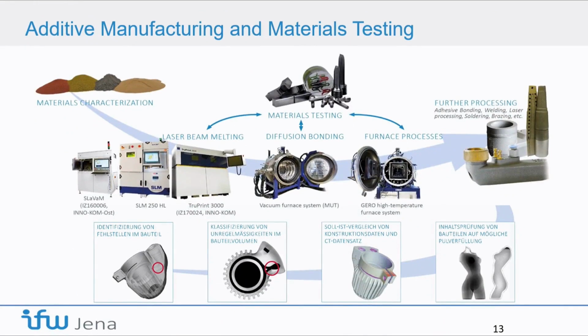So in additive manufacturing, we have several processes: sheet lamination for diffusion bonders, DED for metals, 3 different processes. We have material extrusion of metals, and also powder bed fusion machines. And this I will talk about. We start in the process chain with the characterization of the materials. We had materials in our system starting at a kilogram price of €5. These were powders for fireworks, copper powders we had in the materials for testing. On the other end, it's a 5-digit euro sum for 1 kilogram for aerospace applications, for example.